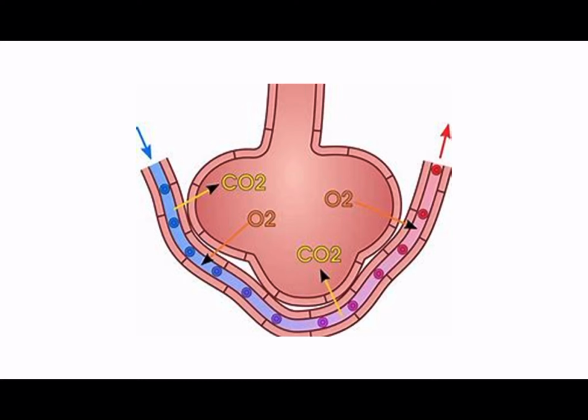I keep saying it, but ventilation and oxygenation are essentially not clever processes. They don't care whether you're in inspiration or expiration. As long as that alveolus is full of gas, and that gas has a higher concentration of oxygen in it than the blood flowing through, you will constantly get oxygenation of blood. And so that's what APRV is really trying to do, is to maximize the amount of time that the lungs are full of gas, and therefore you're maximizing the time for oxygenation.